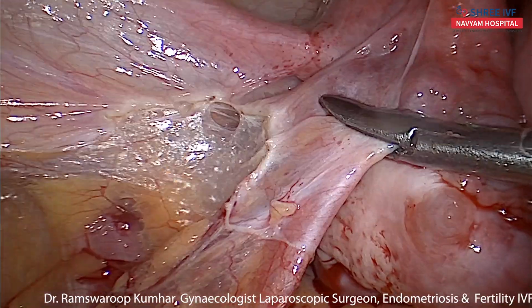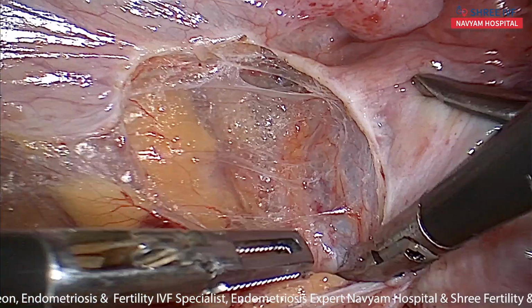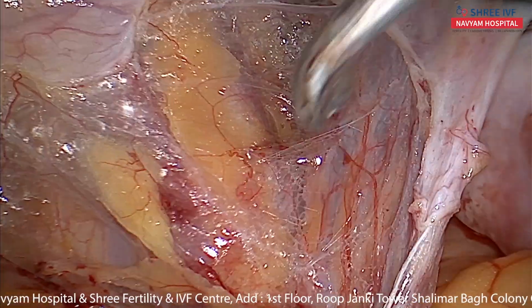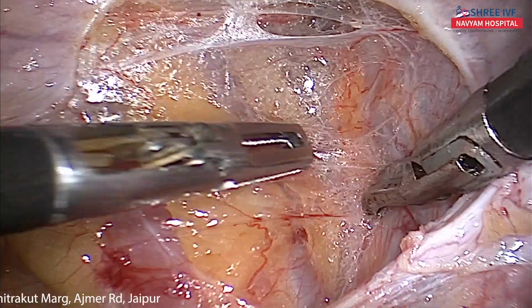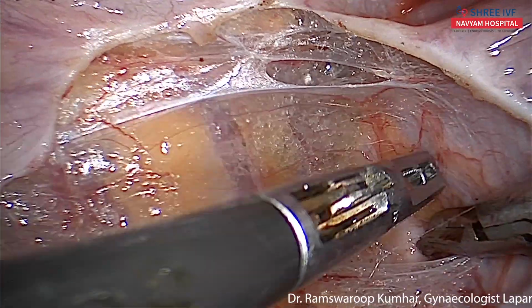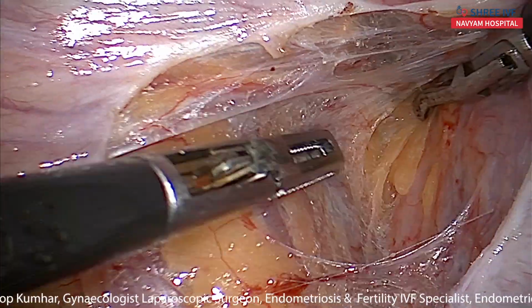The first step is to catch hold of the IP ligament and give traction medially. The first structure after retroperitoneal dissection is the ureter. We have to identify the ureter first. This is the external iliac vessels, and medially this is the ureter. In less than 2 seconds, the ureter is well identified.